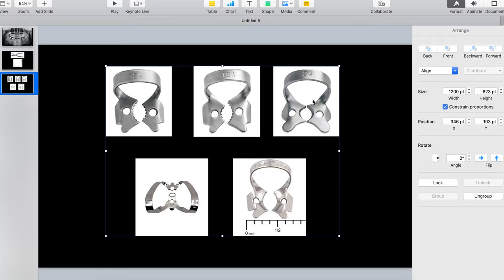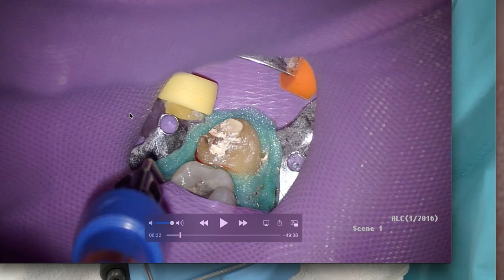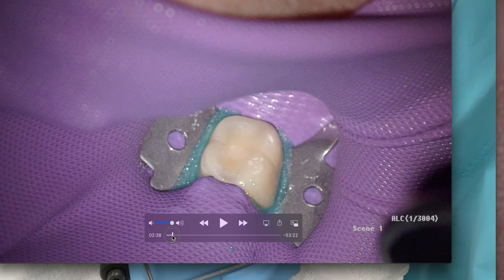The 2a clamp is the go-to. There's a 2 and a 2a — I just learned today there's a difference. The 2 is a little bit weaker; the 2a is bulkier. Use the 2a for premolars, but I also use it in certain molar situations, as I'll show you.